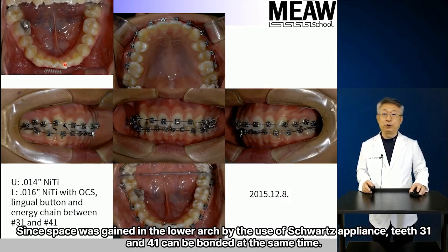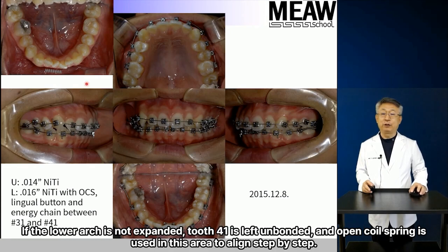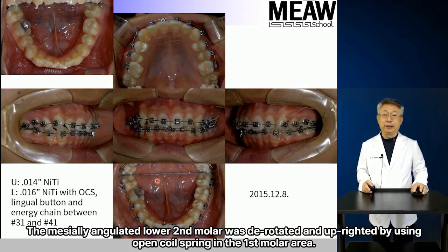Since space was gained in the lower arch by the use of Schwartz appliance, teeth 31 and 41 can be bonded at the same time. If the lower arch is not expanded, tooth 41 is left unbonded, and open coil spring is used in this area to align step by step. The mesially angulated lower second molar was derotated and uprighted by using open coil spring in the first molar area.